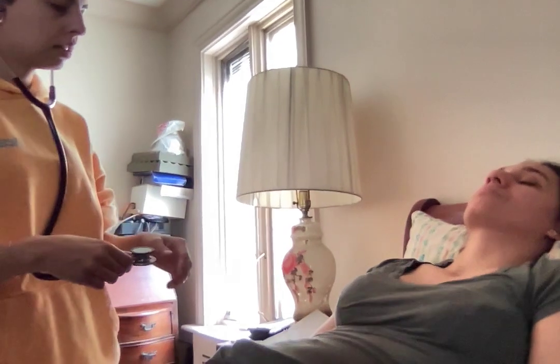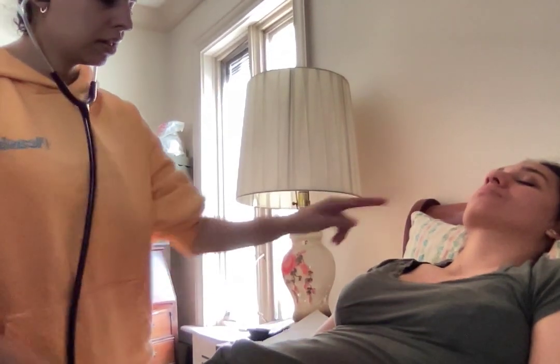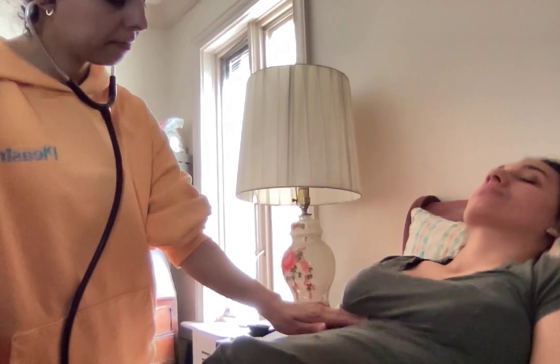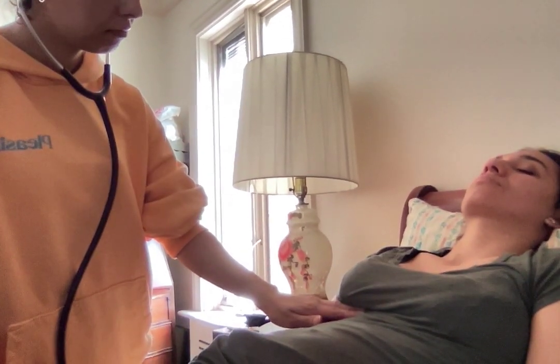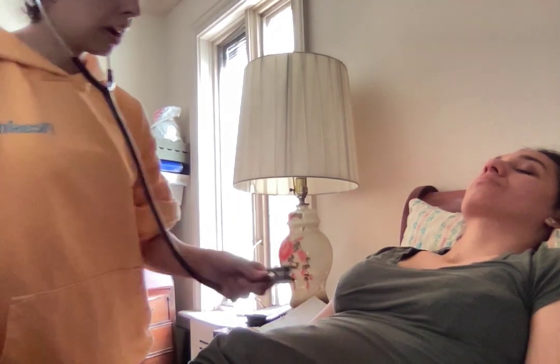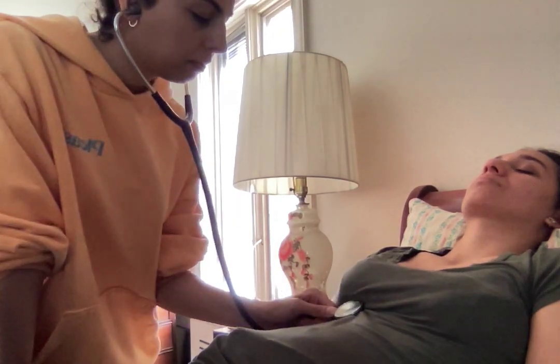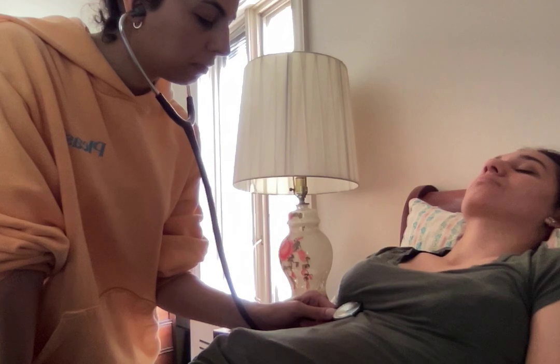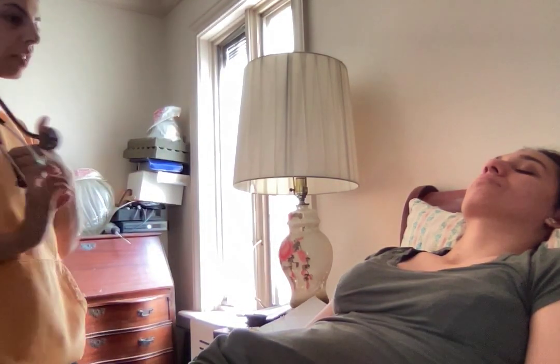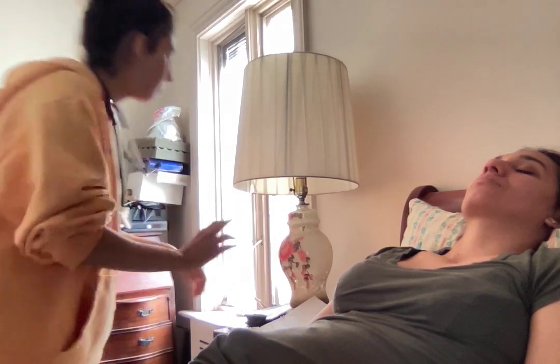Okay, and while you're lying down, I'm going to listen and assess for the apical. Fifth intercostal space. So I'm going to feel for it. Okay, and then I'm going to listen using my bell. Okay, no bruit heard. I'm going to assess your carotid.